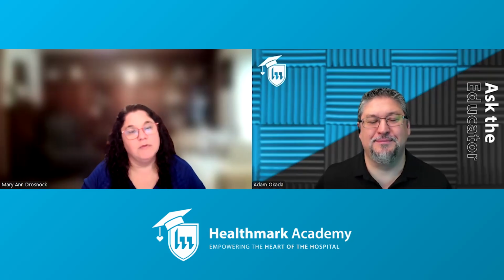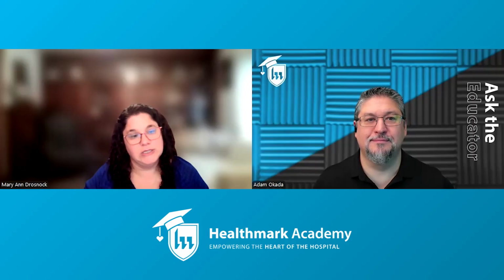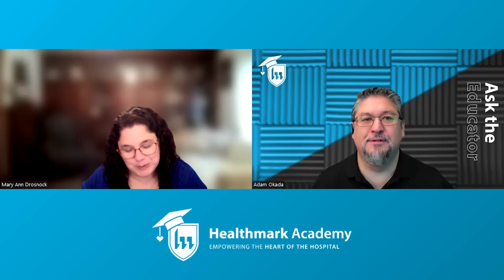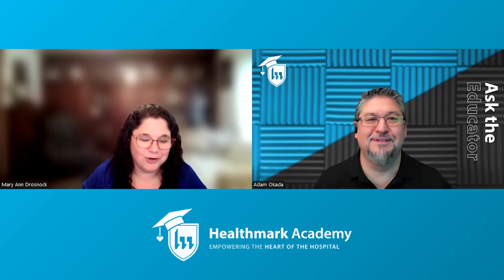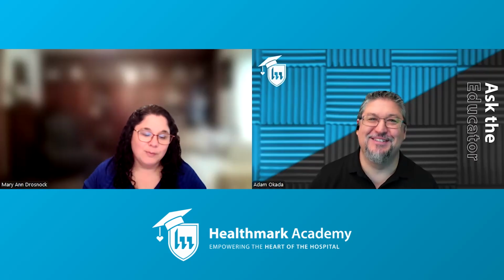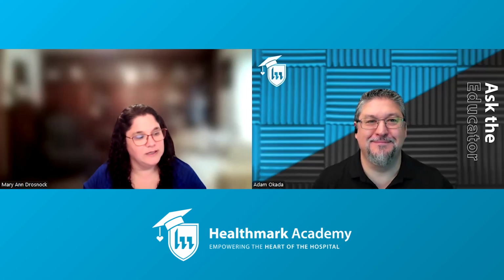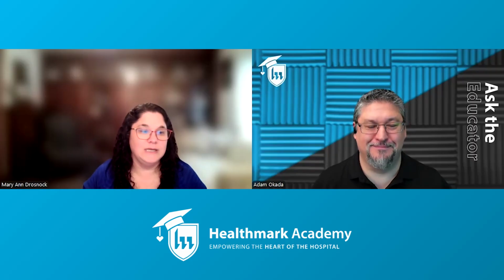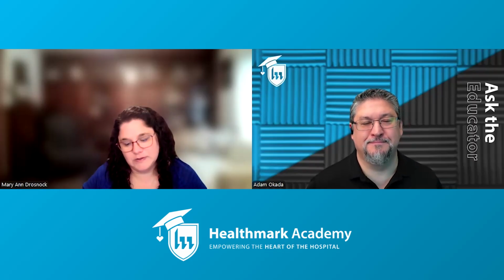So it really came from the end users telling us that 30 seconds isn't enough time to do a good, thorough leak test, that we upped that and changed it to 60 seconds. Sometimes people erroneously think that we change things just to make it harder or make the process longer. But a lot of times it's the feedback from the actual technicians in the facility telling us that they're not able to do that, so we need to make it more stringent. So this is one of those cases where that came from. But there are other things to look at.